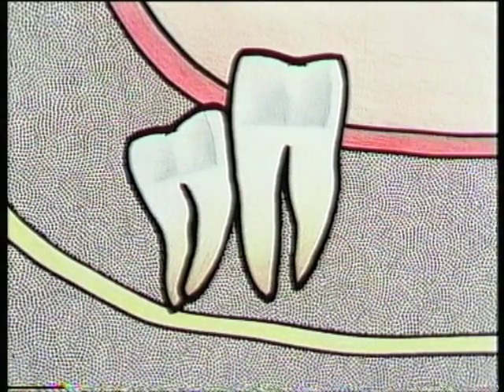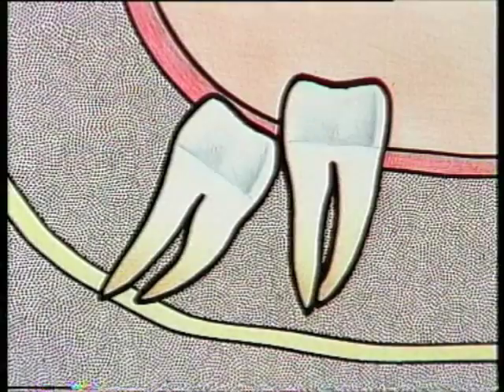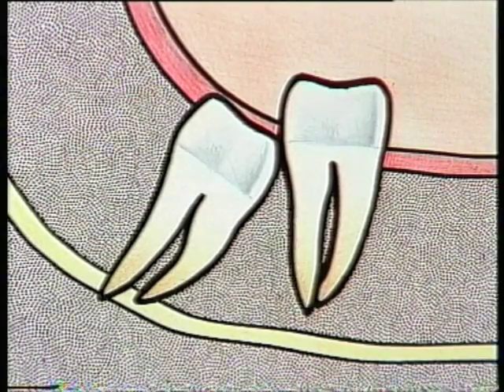Here's another problem. A disto-angularly impacted third molar, lying so close to the distal second molar root as to give the appearance of having no interdental bone. A suitable point of application of an elevator is made more difficult, and damage to the distal second molar root might occur. The morphology of the roots of the second molar is also of importance, since if, as in this case, they are conical, there is a real possibility of elevating this tooth along with the third molar.